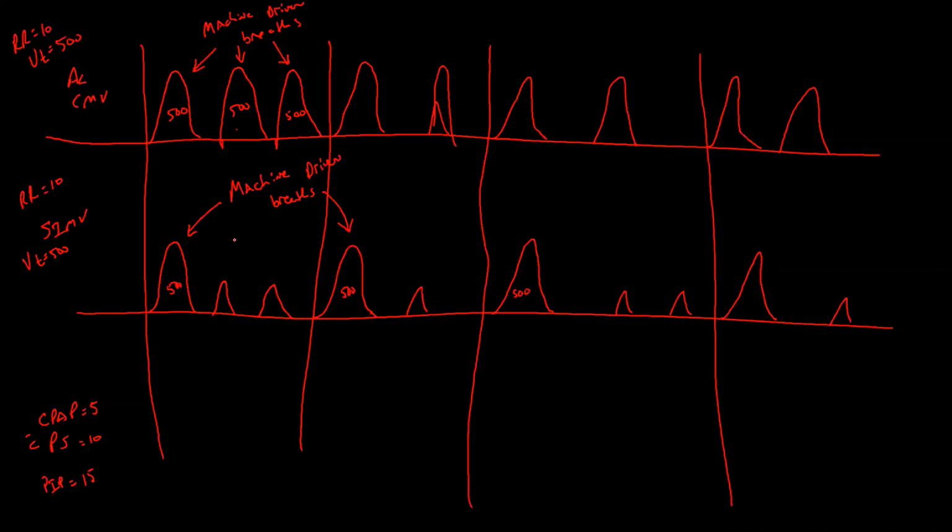These smaller breaths are pressure support breaths. So we can adjust these up or down. They don't have to be small like that. They usually are smaller than the volume breaths. But what we've done here is we have another mode that we put on. We say pressure support equals whatever we want. Let's say 10 in this situation.